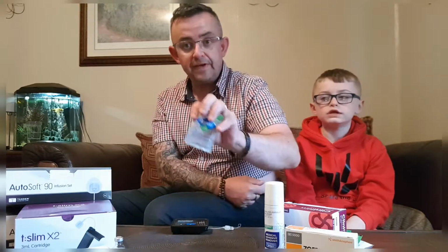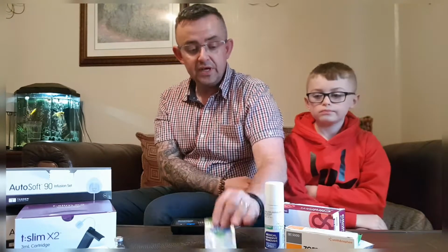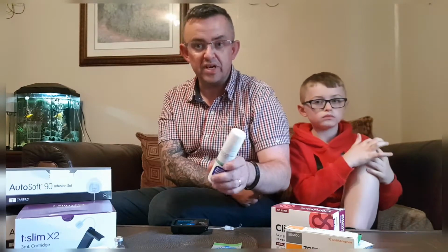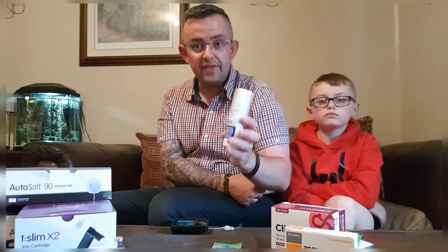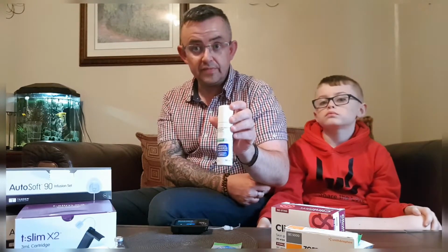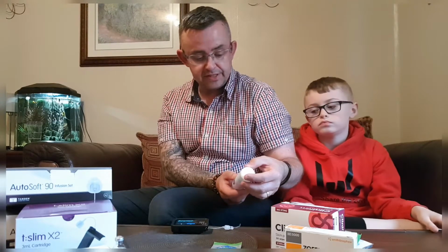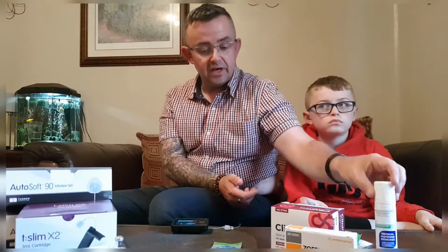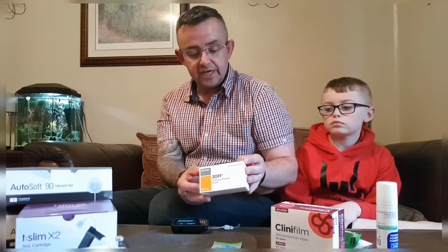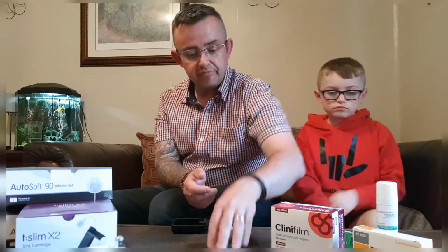At the moment, I'm favouring this one. This is a Peel, a medical adhesive remover wipe. I have tried the spray, but the spray is that aggressive, if you like. It goes everywhere and it stings. So I might have that taken off my repeat list. So that we won't be using, but some people might like that, and some people might get on with it. This one I bought from the local pharmacy. It's called Zoff. Again, it's an alcohol adhesive remover wipe. That works really good. But today I'm going to show you this one.